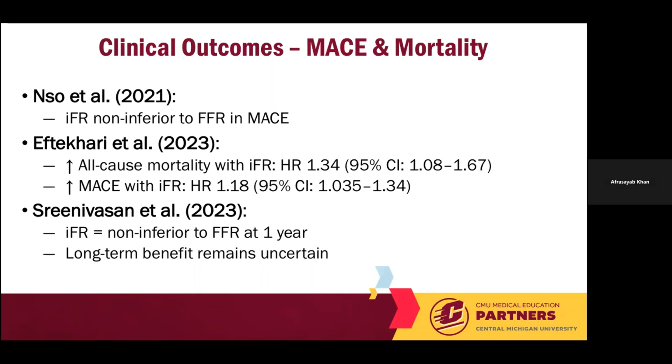There was a study in 2021 which showed that IFR could be non-inferior to FFR in terms of major adverse cardiovascular events in patients in which IFR is used for assessing a lesion versus FFR. However, there was another study which did show that there could be increased all-cause mortality in patients in which IFR is used as compared to FFR.